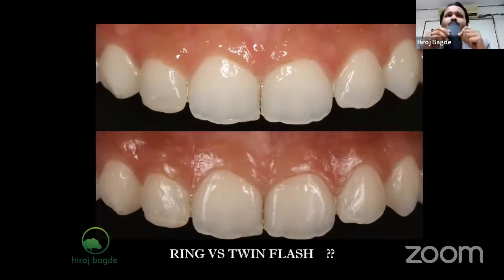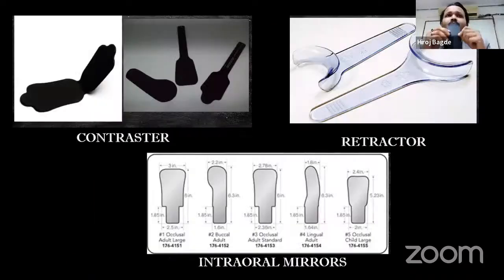This can be skipped, but retraction cannot be skipped. The most important thing is, whenever we go for palatal aspects, lingual aspects, or buccal side, we need mirrors. Different kinds of mirrors are available in different sizes, from different companies. Among them we have the rhodium coated mirror. The rhodium coated mirror is the standardized one.